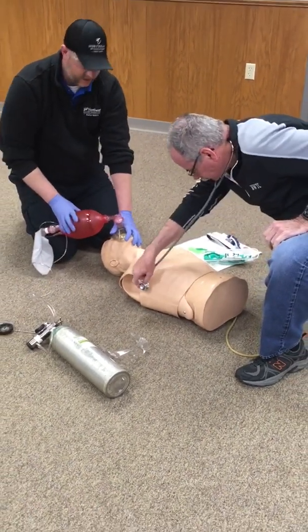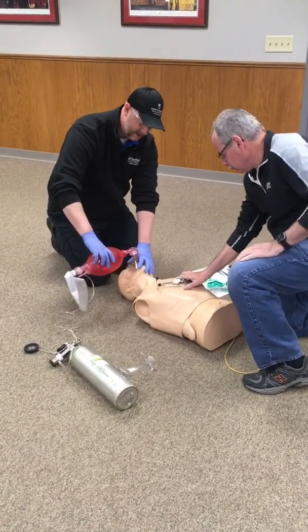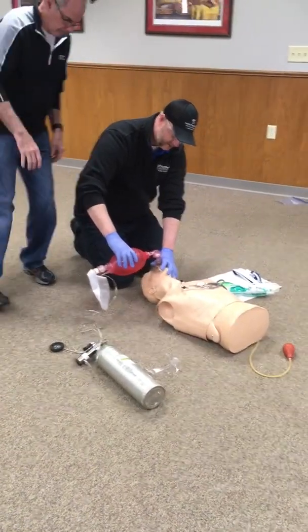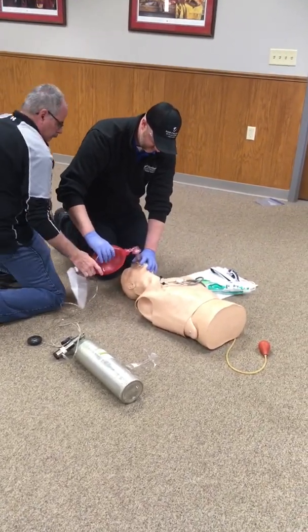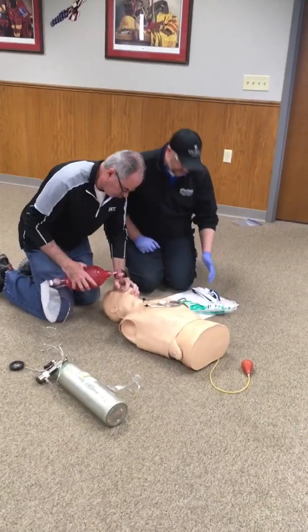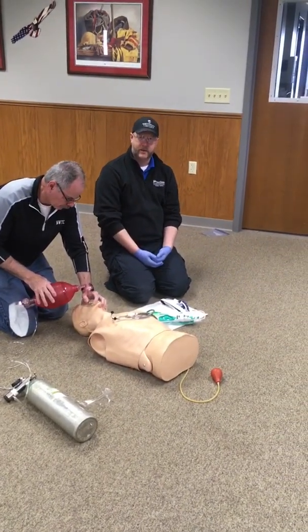Once they tell me that, I'm going to have the evaluator or assistant go ahead and take over ventilations, providing ventilations with oxygen one breath every five to six seconds. While they take over ventilations, I'm going to go ahead and prepare my supraglottic airway.